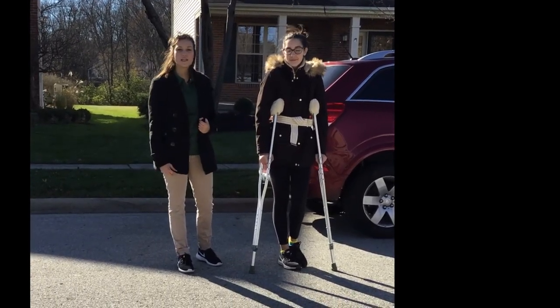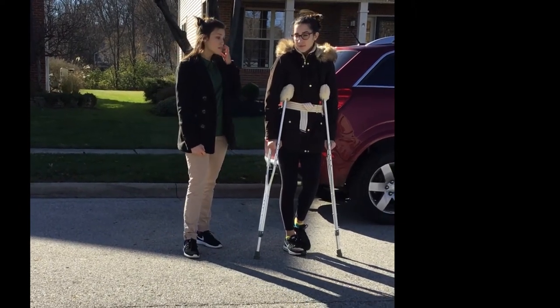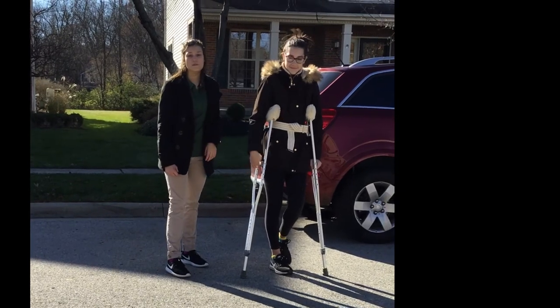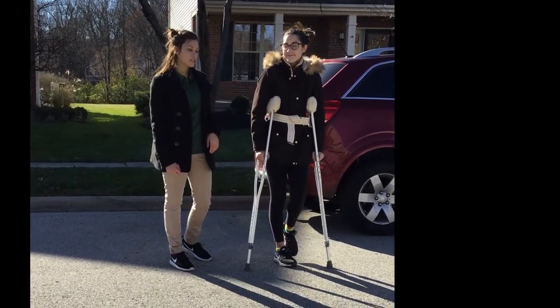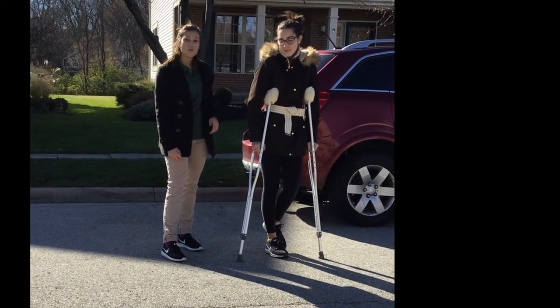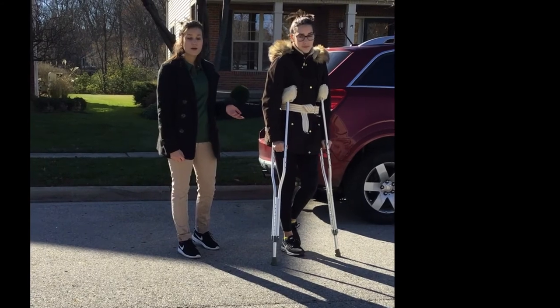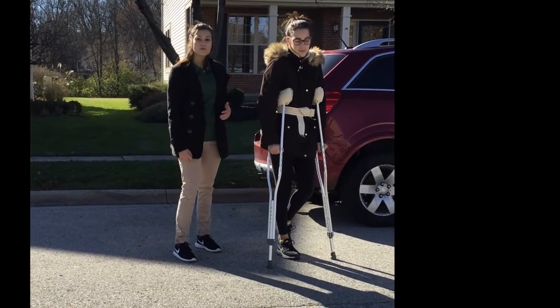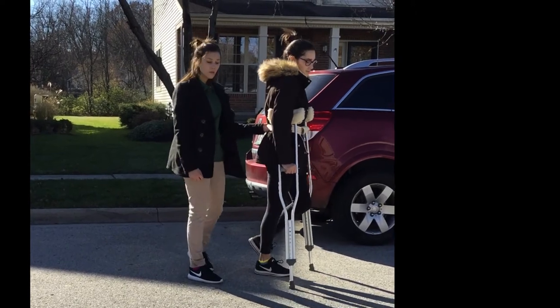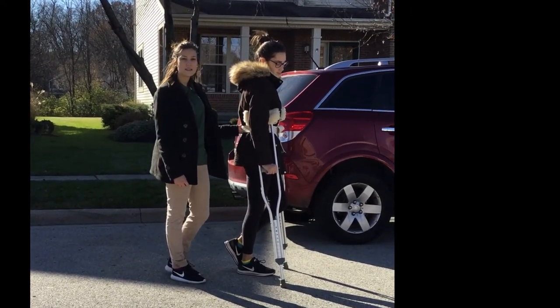If your patient is new to the transfer or is feeling unsteady, you will want to guard them throughout the transfer. So now I have my assistant Mac and I'm going to show you how to properly guard a patient while doing a car transfer. First, you want to put a gate belt on your patient — Mac already has her gate belt on. You will then hold on to the gate belt with your palm up and walk behind and slightly to the side of the patient throughout the transfer.